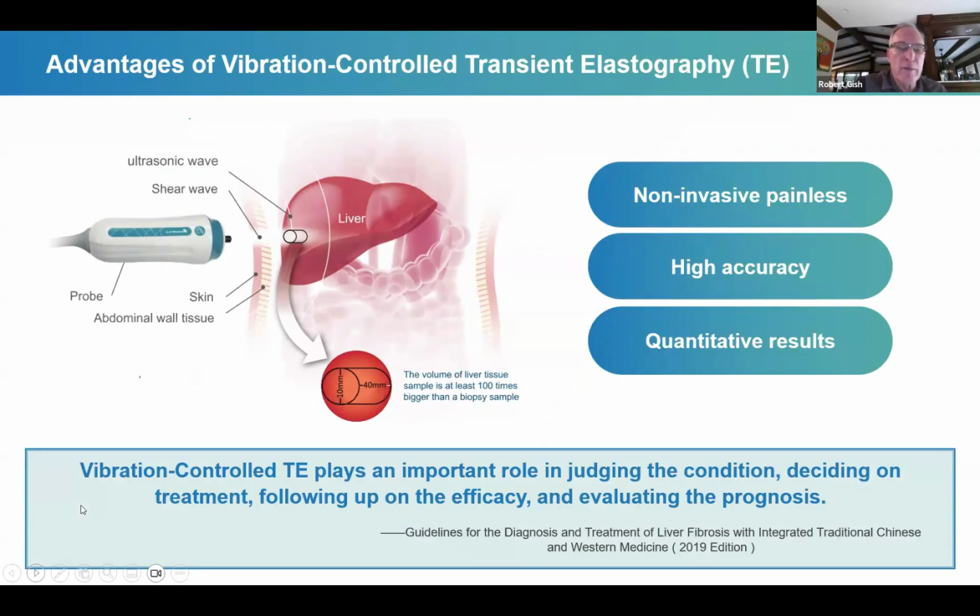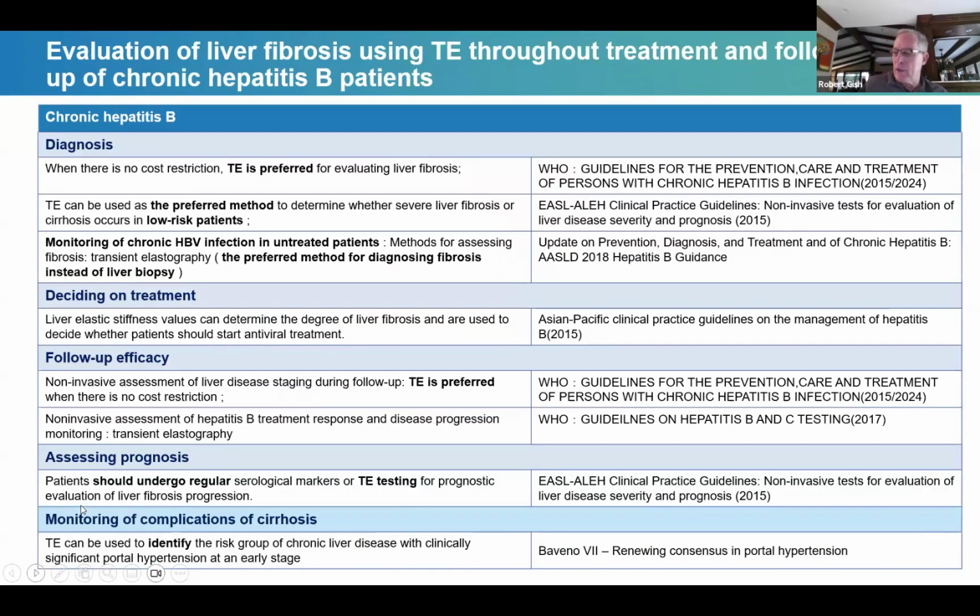Vibration controlled transient elastography is listed in a variety of different guidelines. And interestingly, this technology is being reviewed by the US FDA as a potential replacement for liver biopsy in clinical trials, which I think is fascinating because if we could replace liver biopsy in clinical trials, trials could move forward in a much more streamlined fashion.